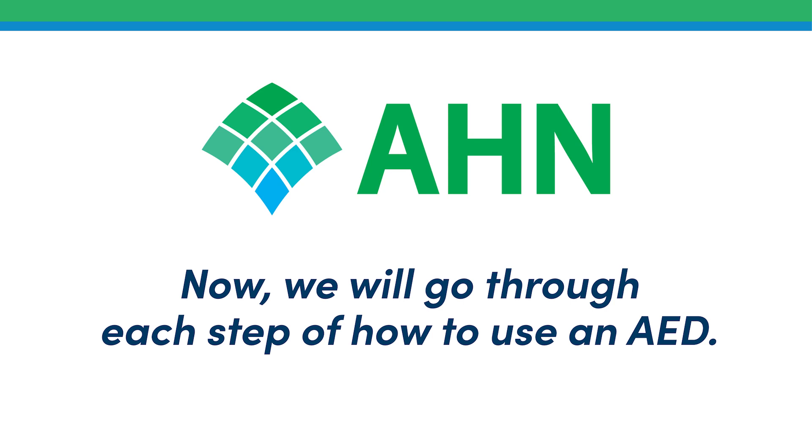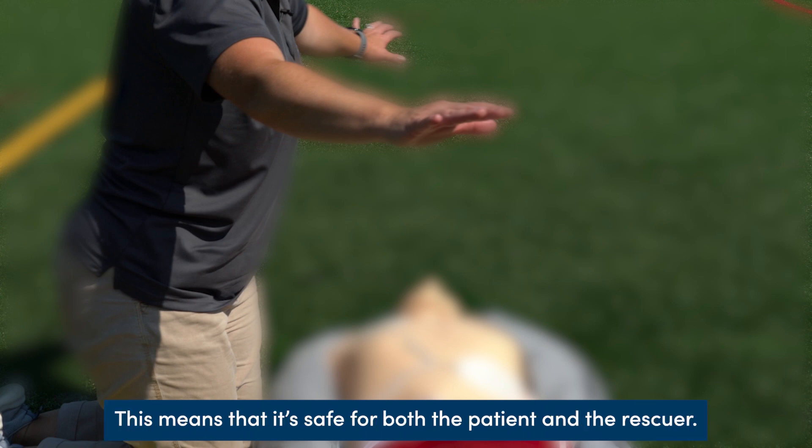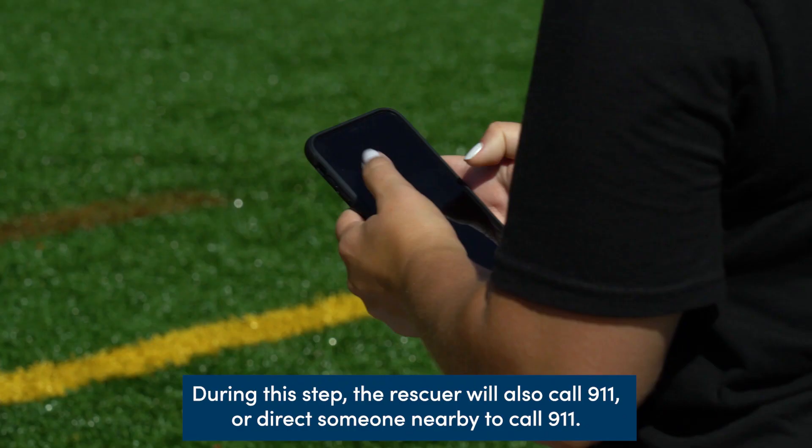Now we will go through each step of how to use an AED. It is important to check that the scene is safe — for both the patient and the rescuer. During this step, the rescuer will also call 911, or direct someone nearby to call 911.